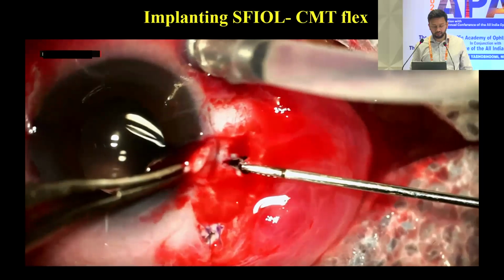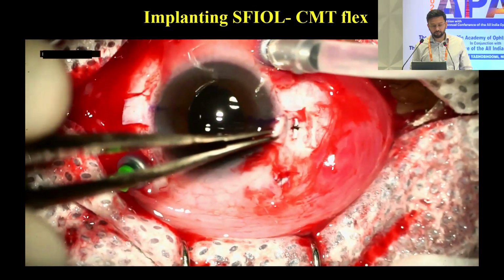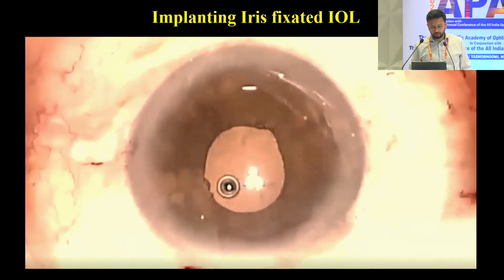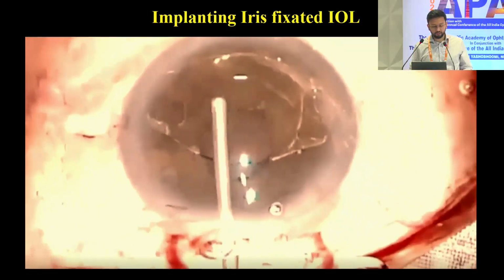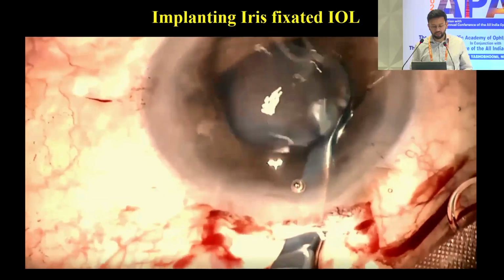So the second haptic comes out, and then we can seal these scleral flaps with glue, or we can also suture it. We can also implant iris fixated IOLs either in the anterior chamber or, like in this one, we can fixate it posteriorly as well, behind the iris.